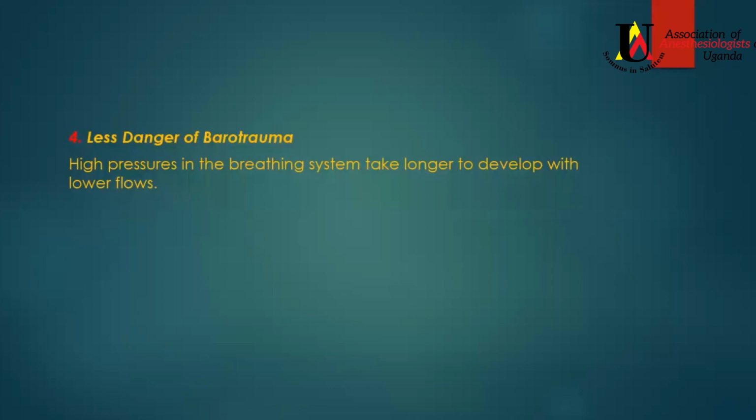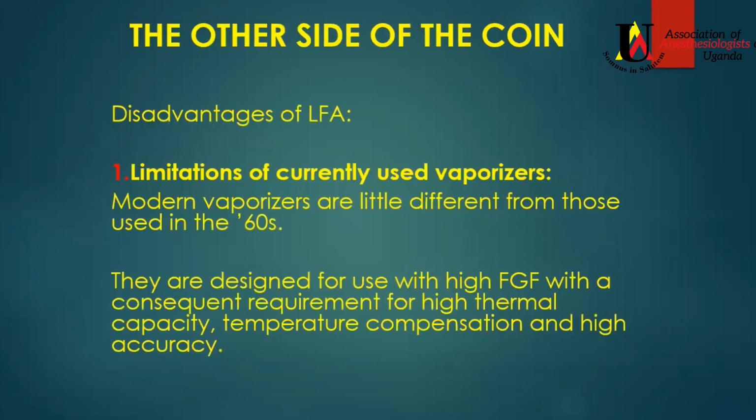There's less danger of barotrauma. Of course, you are running very low pressures in the system. So volume trauma is very unlikely, but then there are also disadvantages. One, limitation of currently used vaporizers. As we said, the modern vaporizers are not so different from the old ones.